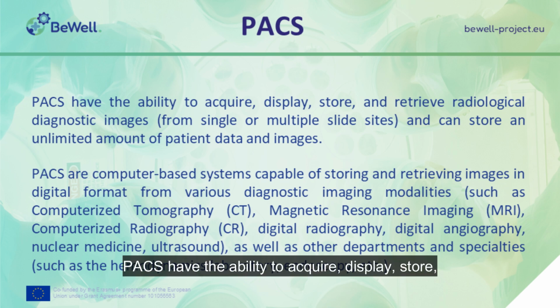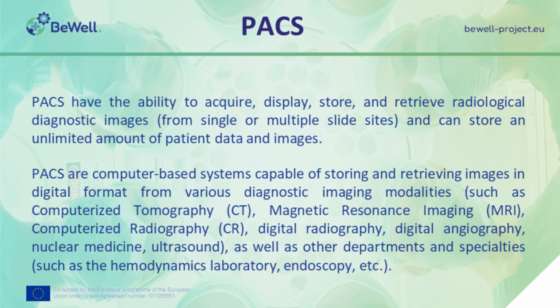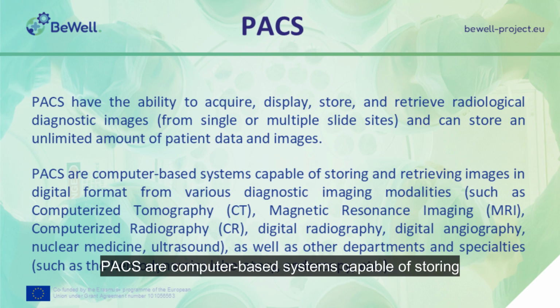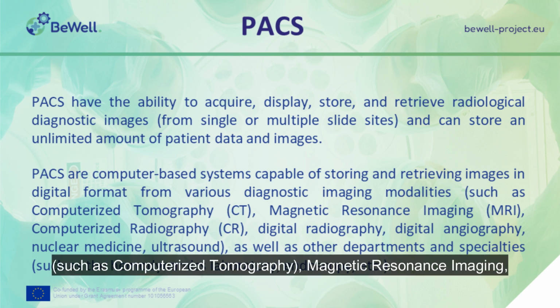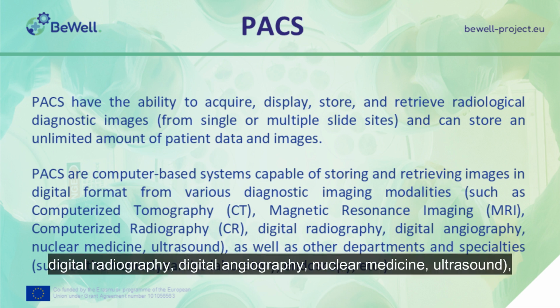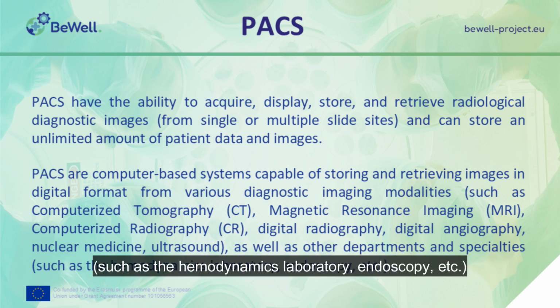PACS have the ability to acquire, display, store, and retrieve radiological diagnostic images from single or multiple slide sites, and can store an unlimited amount of patient data and images. PACS are computer-based systems capable of storing and retrieving images in digital format from various diagnostic imaging modalities, such as computerized tomography, magnetic resonance imaging, computerized radiography, digital angiography, nuclear medicine, ultrasound, as well as other departments and specialties, such as the hemodynamics laboratory, endoscopy, etc.